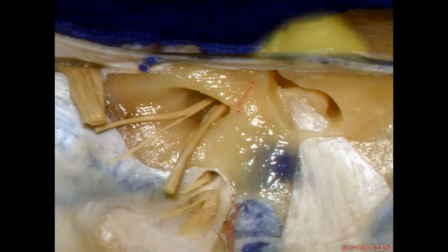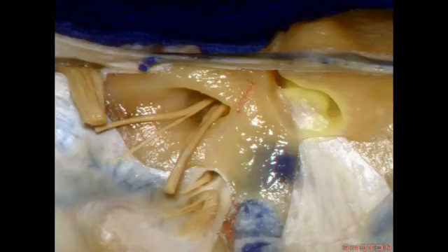And what is this? What is that prominence? Arcuate. And what canal is that? Superior. And this is the canal of the posterior fossa, the posterior canal, the canal of the middle fossa. What did I drill into here? Common crus, the junction of the back end of the superior canal and the up end of the posterior canal.